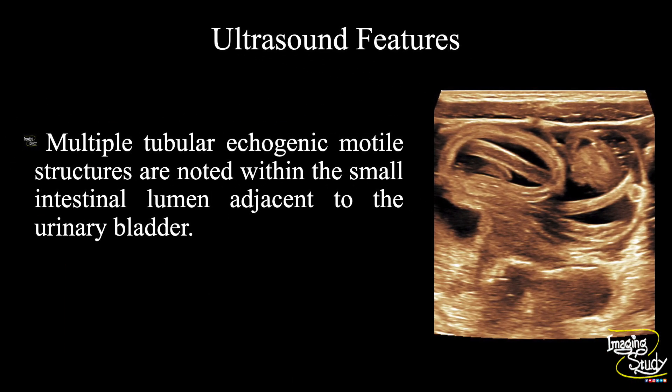In summary, multiple tubular echogenic motile structures are noted within the small intestinal lumen adjacent to the urinary bladder, suggesting this as a case of intestinal ascaris.